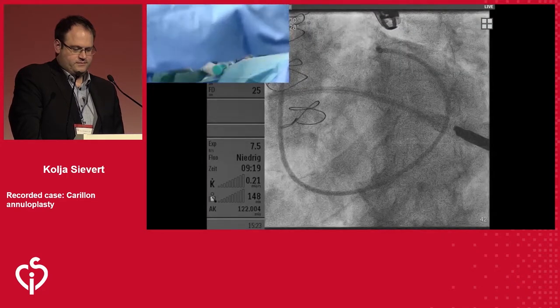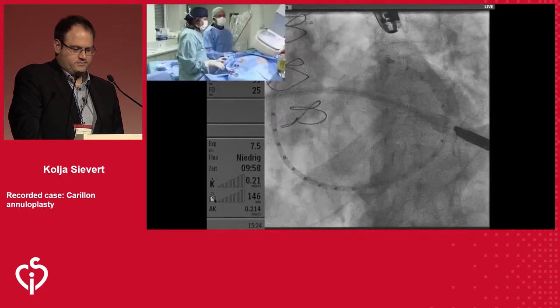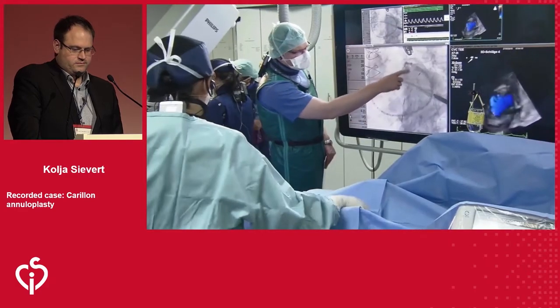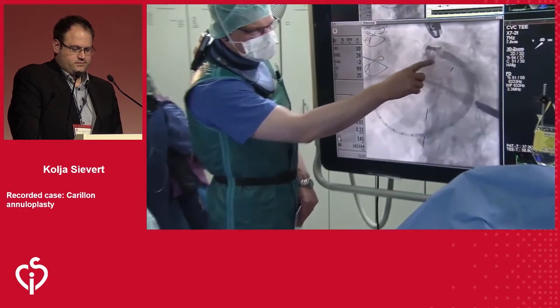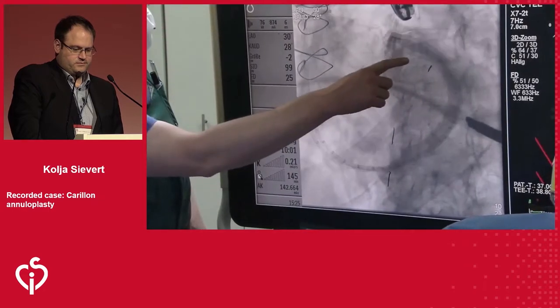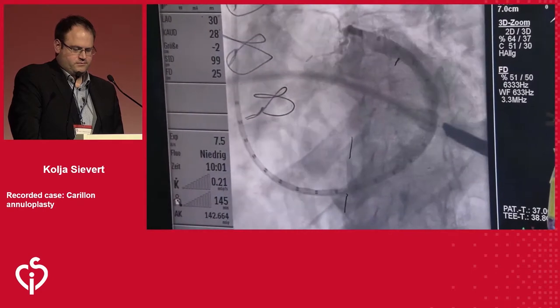Should we do another measurement with the... I would. Yeah. So I like this position. It gives us an extra 2 centimeters. I think this is going to be nice. Because of this bulbous segment right here at the distal end of the great cardiac vein, I really think this is a nice place for a distal anchor because of the favorable anatomy for the anchoring.